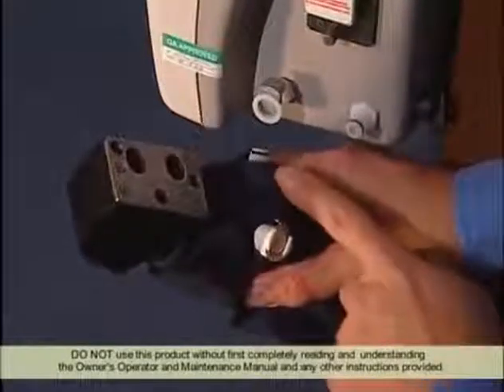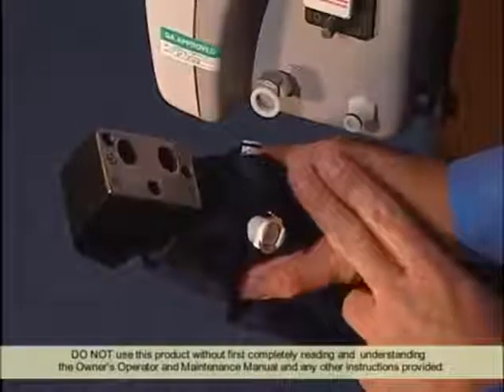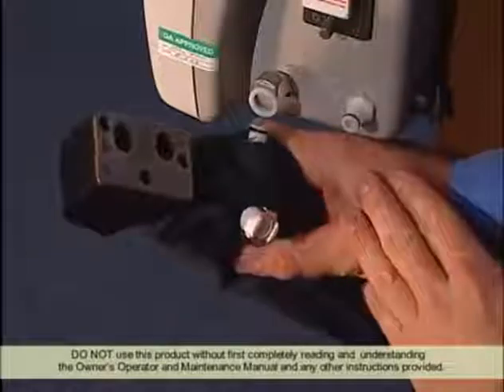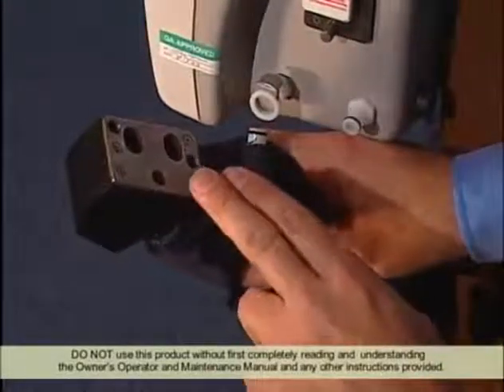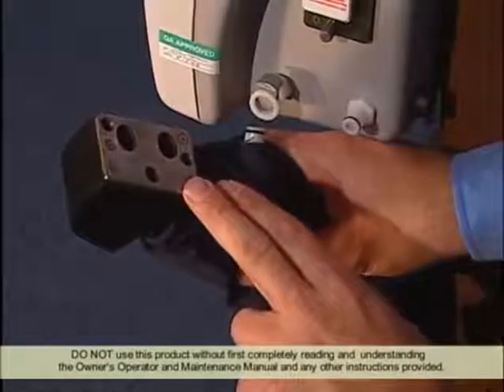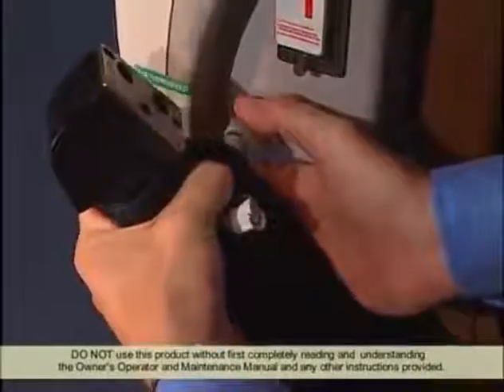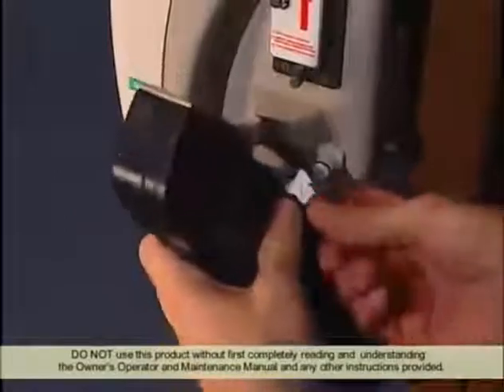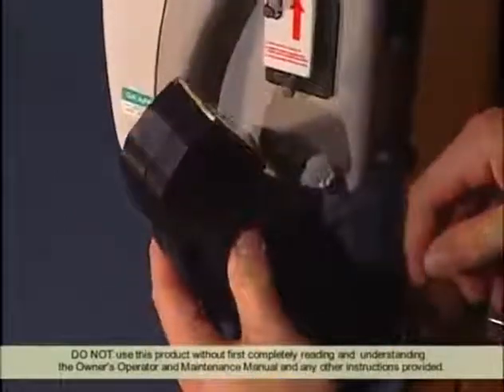We have an additional connector for the bolsters underneath to achieve additional degrees of turn, and another hose here for the side rails. The largest is the magnetic connector. It's inherent on both of our blower models and provides the most positive seal it can get. When you're connecting it, you want to start at the bottom and push them in until you hear that snap. Line up the holes, and it's ready to go.